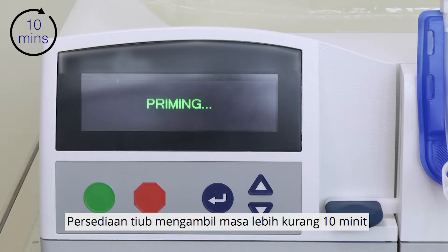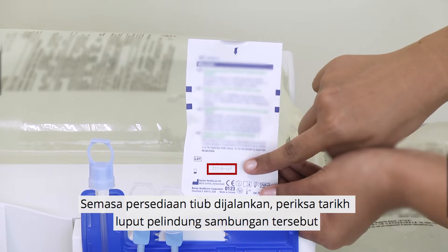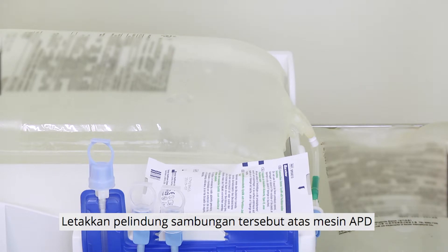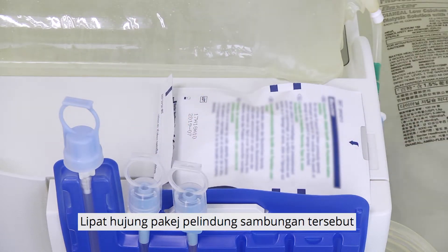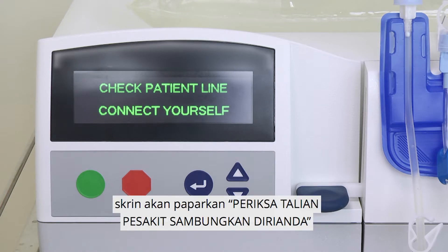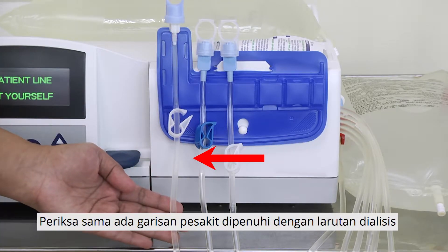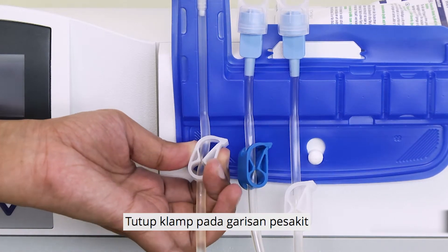Priming of the lines will take about 10 minutes. While priming is in progress, check the expiry date of the connection shield and place it on the APD machine. Fold the end of the connection shield package. After the APD machine has completed priming, the screen will show 'Check Patient Line, Connect yourself.' Check that the patient line is filled with dialysis solution. If the line is not filled, re-prime. Close the clamp on the patient line.